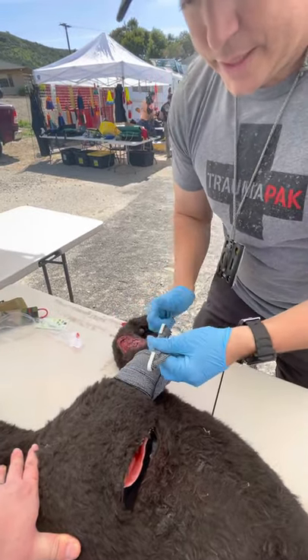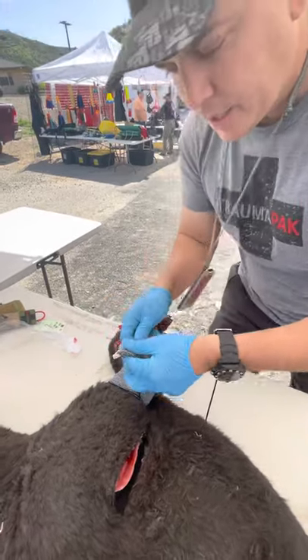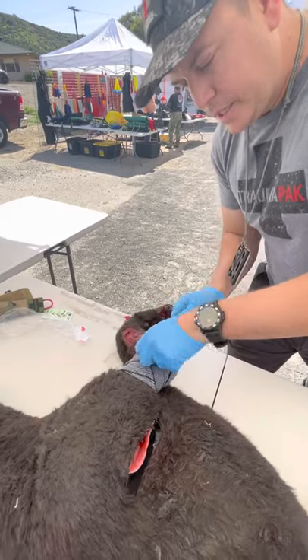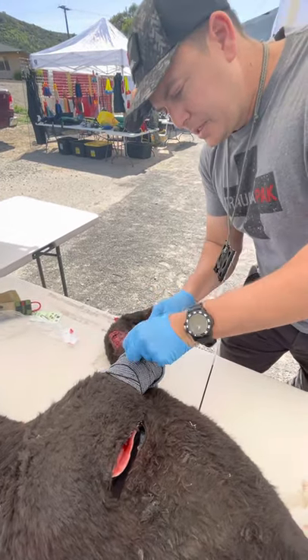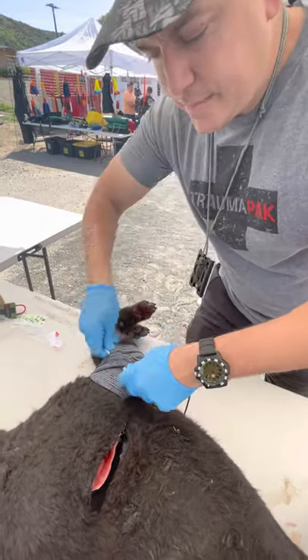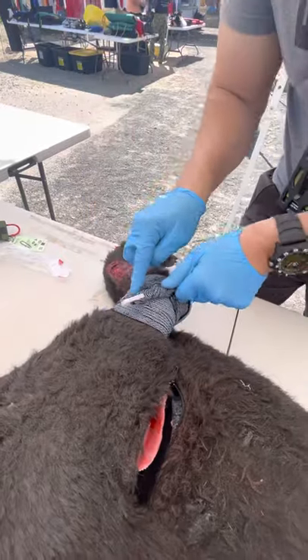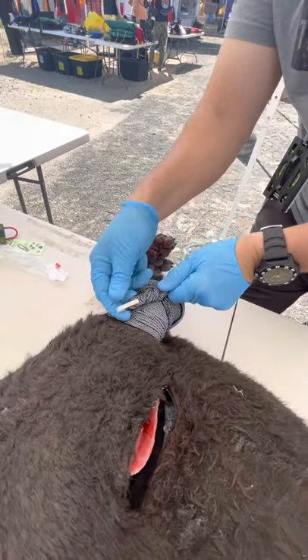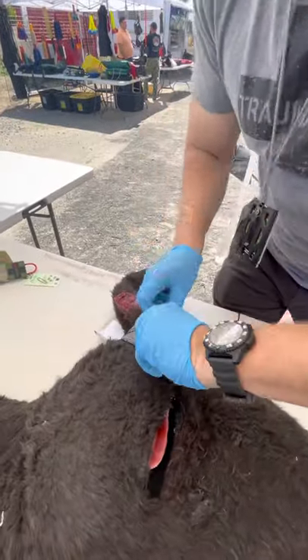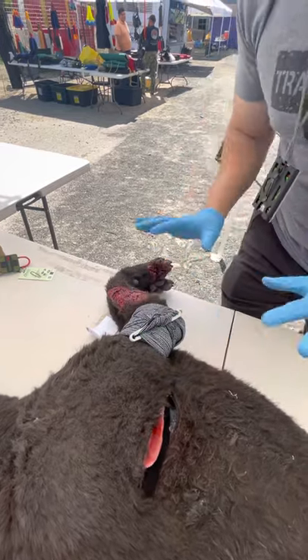Here's a quick technique: let's say you went really soft and they're still bleeding. With this locking bar right here, you just go back one or two of these folds, and I personally like to go back two. Put them underneath, and now you can use this as a kind of modified windlass. As I'm turning this, it's going to create a lot more pressure and you'll see that it's occluding that bleed. To secure it, you basically just grab a piece from here and all you need is one — and it's secured.